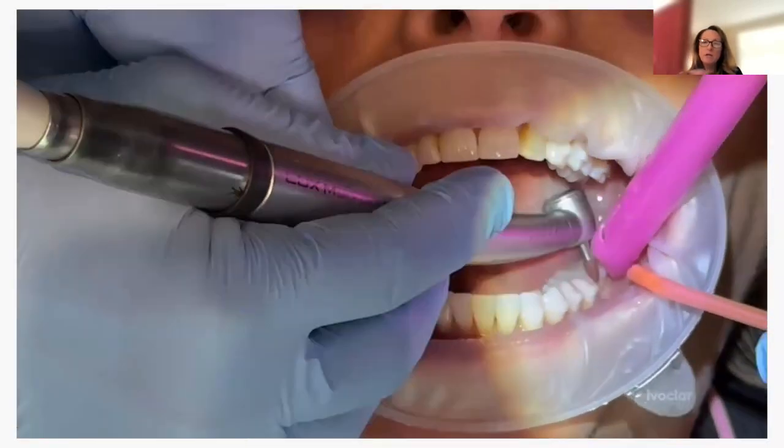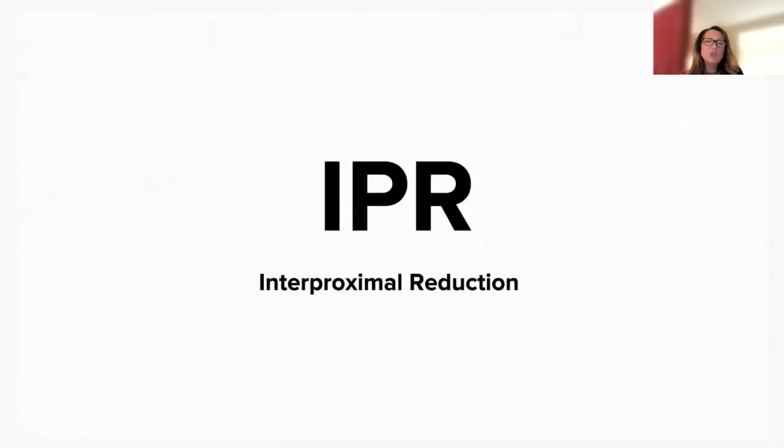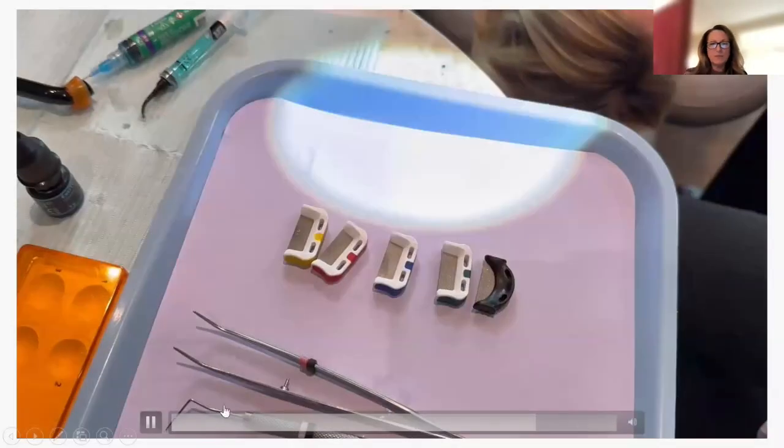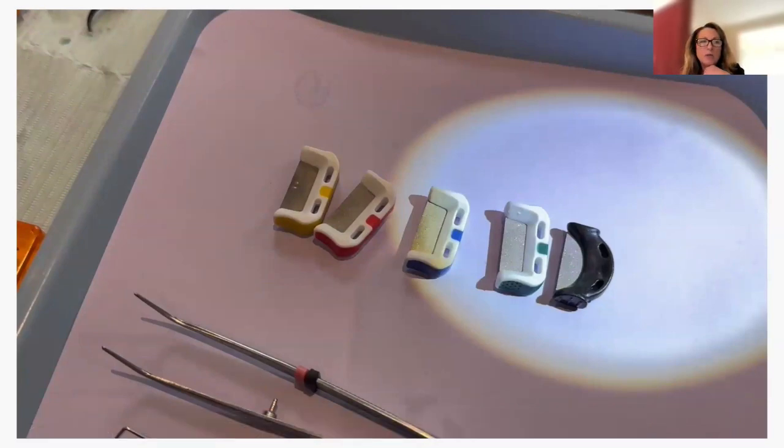But like I said, as you see, most attachments are sharp. If it's too sharp, then let me stop this for 1 second. If you have an area that's too sharp, I don't want a patient's lip to be cut either. Barely smooth it, but I know it's going to feel awkward to them. They're not used to having anything on it. And just like any of you out there that had ortho, or have had friends that had ortho, how they would say my lips are all cut up and they would have a little box of wax to put on.